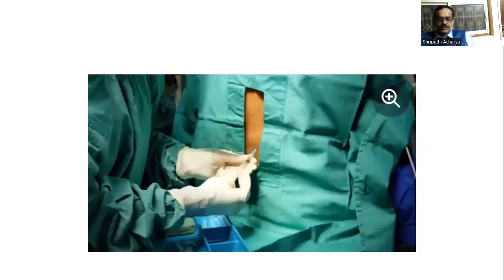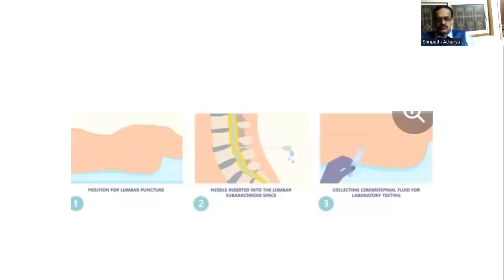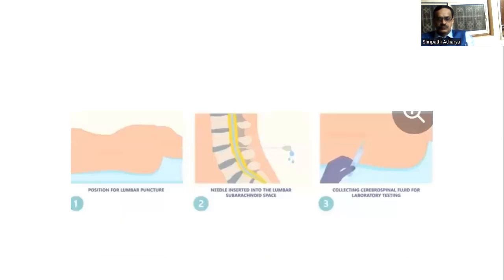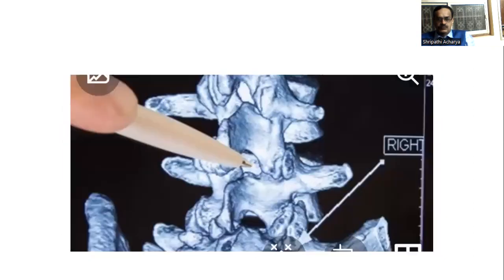Another patient is undergoing lumbar puncture. Area of puncture. The picture shows the structure of the vertebral column.